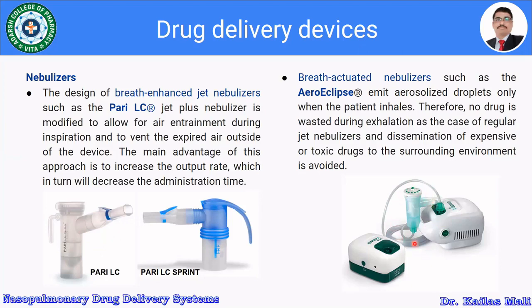Therefore, no drug is wasted during exhalation, as in the case of regular jet nebulizers, and dissemination of expensive or toxic drugs to the surrounding environment is going to be avoided. So this is a further modification in the breath actuated nebulizers, that is the Aero Eclipse.